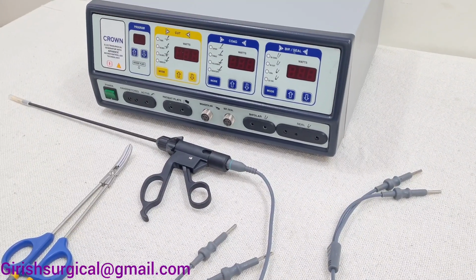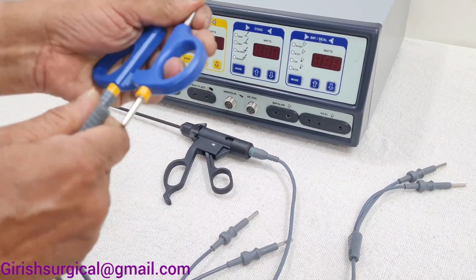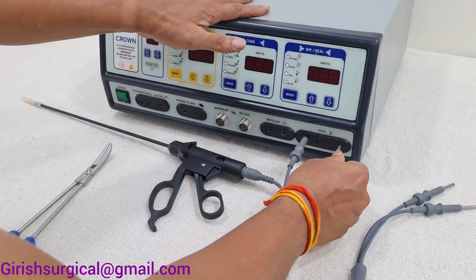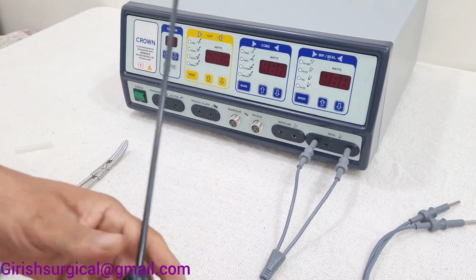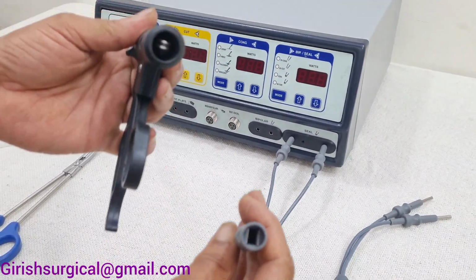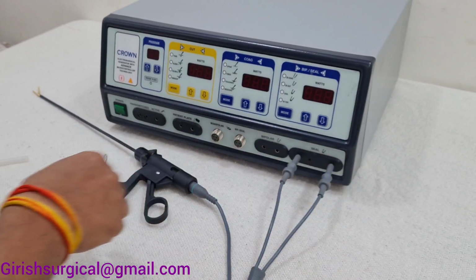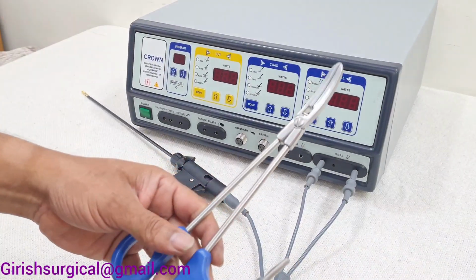Here we are going to see the connection, how to connect the bipolar to the vessel sealer and the bi-clamp. On this bi-clamp, two female pins will be going to the bi-clamp, and on the other end, two banana jack pins will be going to the sealing port. These two holes are there. And this is the vessel sealer, curved one. This you can dismantle here to connect it to the instrument. And these two will be going to the same sealing mode. If you are doing a laparoscopy, you can use this long instrument. If you are doing any open surgery, at that time you have to use the bi-clamp.